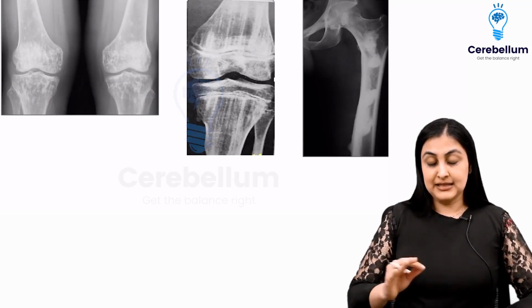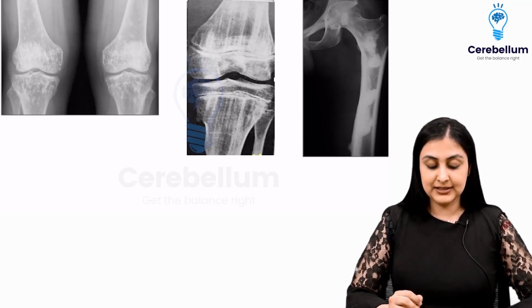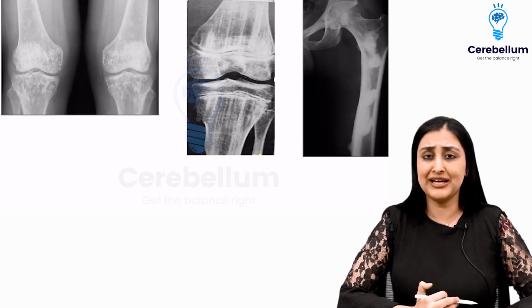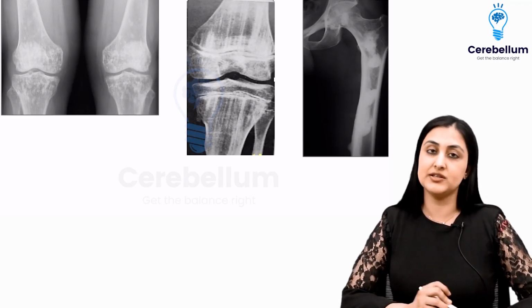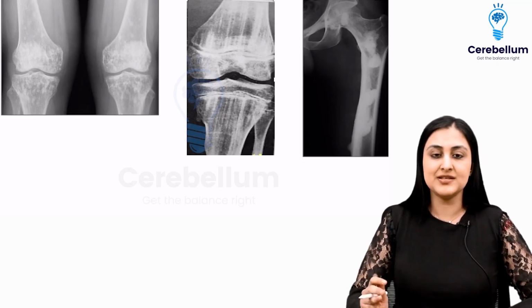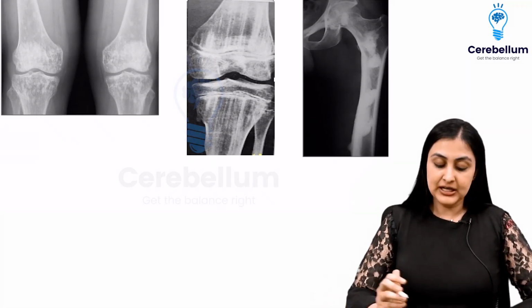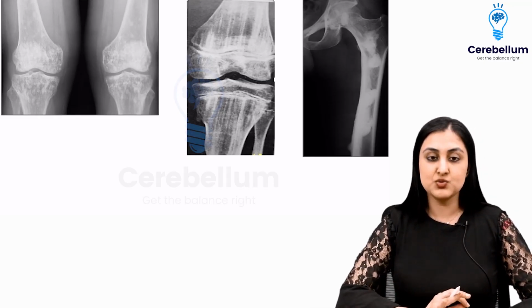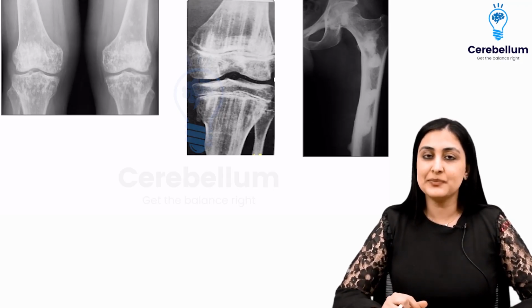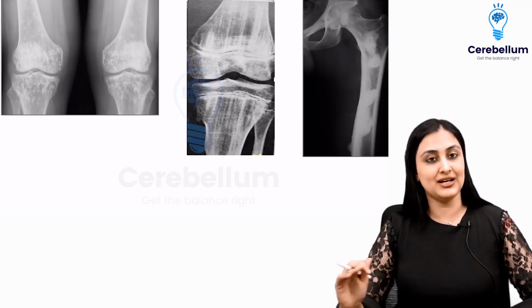Next, we want to discuss three pathologies here. These are three skeletal appearances which make you feel that something's really wrong with this person's bone. But actually, the common thing to all three of them is they're going to have no effect on the overall bony development. These are just dysplasias which give rise to a very scary looking appearance. But overall, you just have to reassure the patient that nothing's going to happen to them.